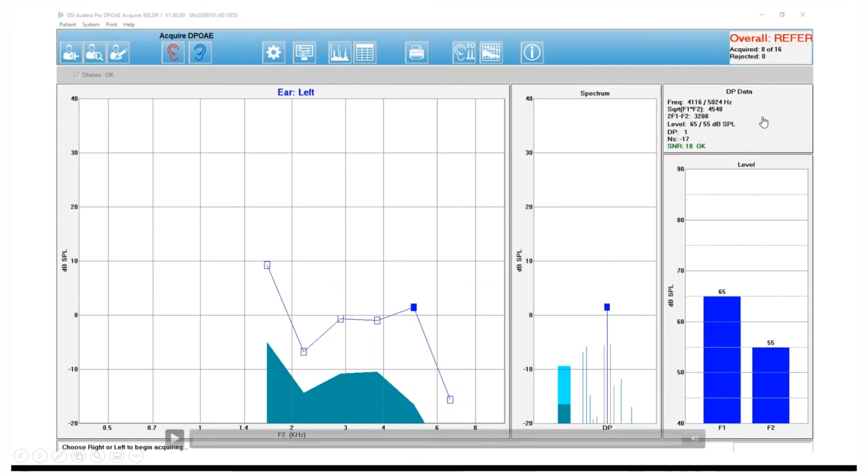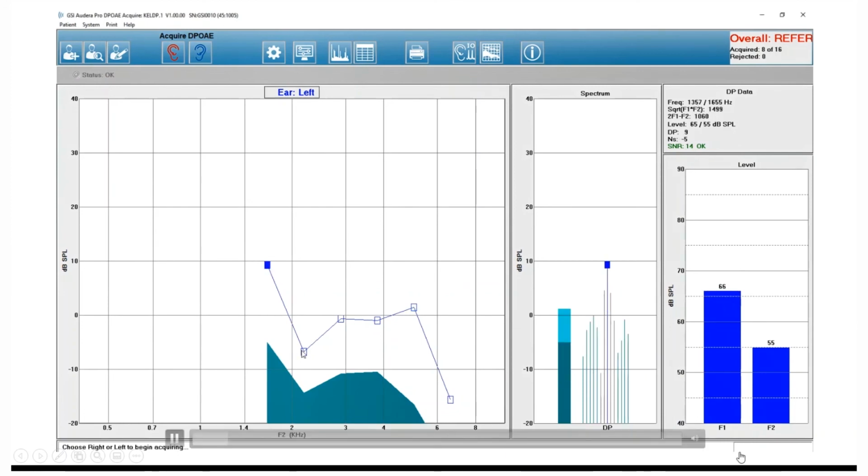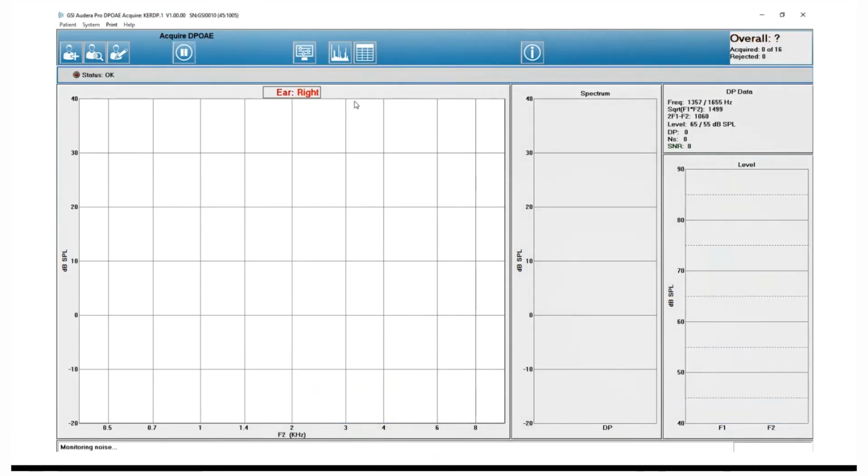Each data point will have different DP data information, and then up at the top right corner is the overall result. I'm going to go ahead and start the recording. If I select a different frequency, then you can see my spectrum level and DP data will change. This is the acquisition screen, and now what I want to do is actually run a test in my right ear. So to do that, all I have to do is put the probe in my right ear and select right ear up at the top.